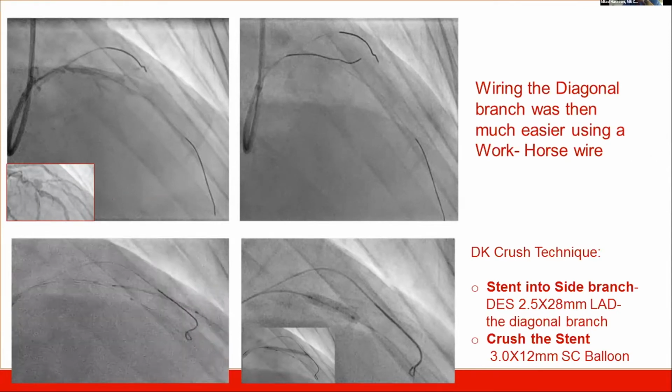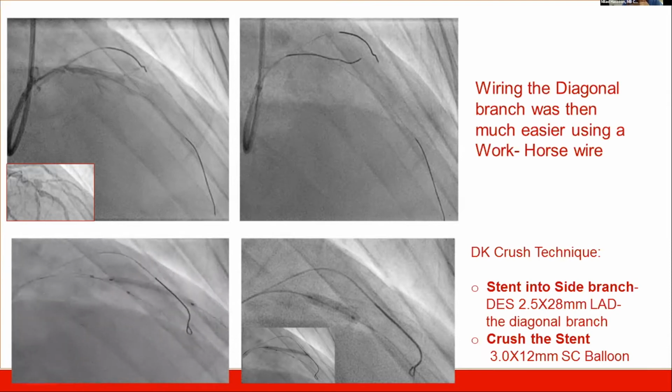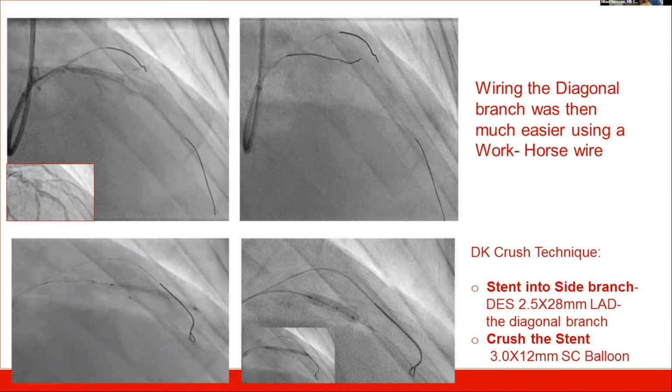Yeah. This is important to gauge how far are you into the main vessel. So we use that as a marker to know how much we're protruding back from the LAD to the main vessel. And this is the rationale of having the initial parking of the balloon.